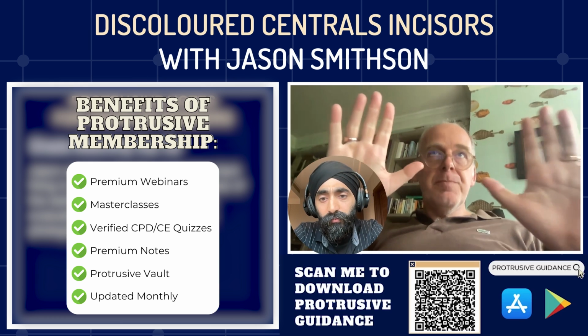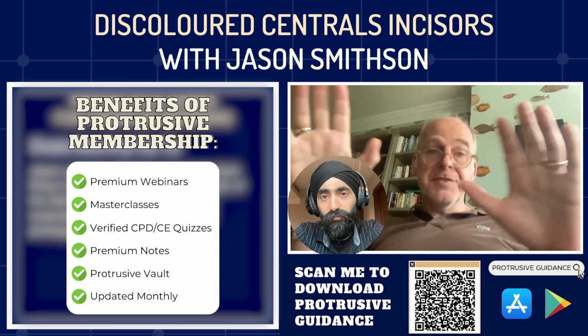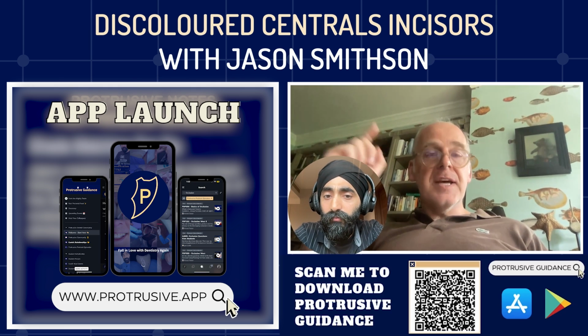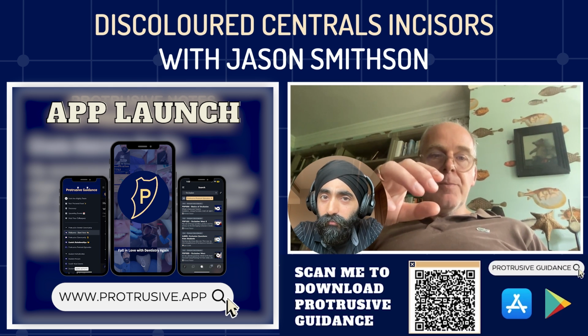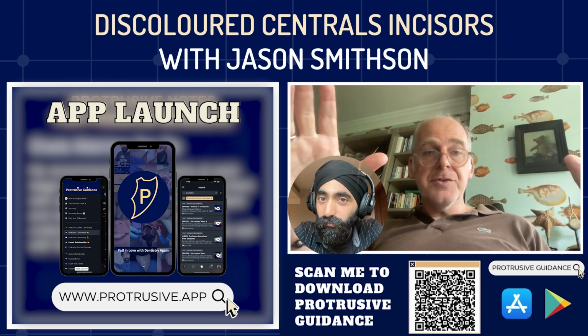So once you've put your opaquer on the tooth, you need to work out whether you put enough opaquer on, because if you haven't put enough on, it's going to end up still being grey. So what you need to do is to take a photograph of that, import that into your computer, convert that to black and white, and then look at it and compare it with the adjacent teeth, and they should be the same brightness or value.